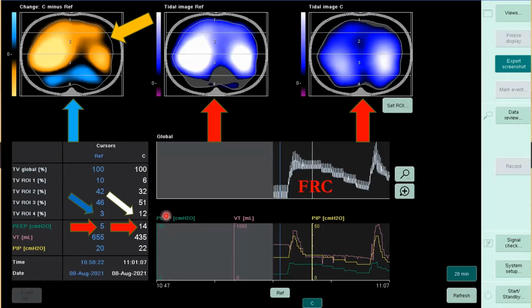If we look here, these are the impedance curves. As you can see up here, this is your PEEP of 14, goes down all the way to 6. So we have 14, 12, 10, 8, and 6. Underneath here, this is actually representing your functional residual capacity. So at a PEEP of 14, we see that the impedance curves or the volume curves are maintaining in a straight line. That means that the 14 has recruited this much functional residual capacity and is able to maintain it.